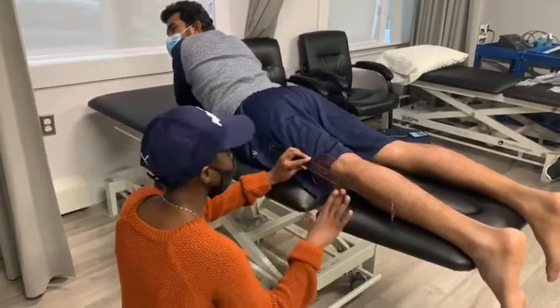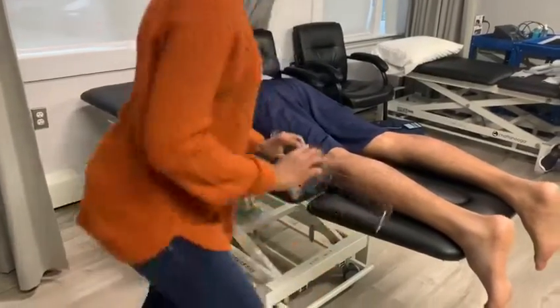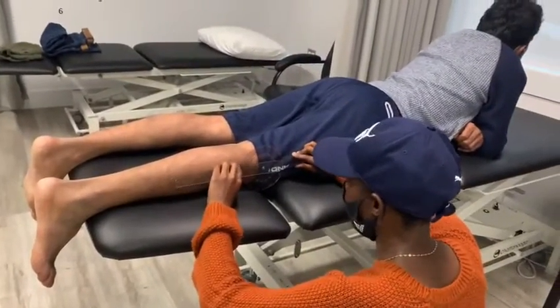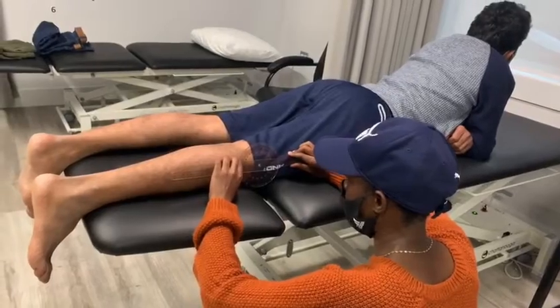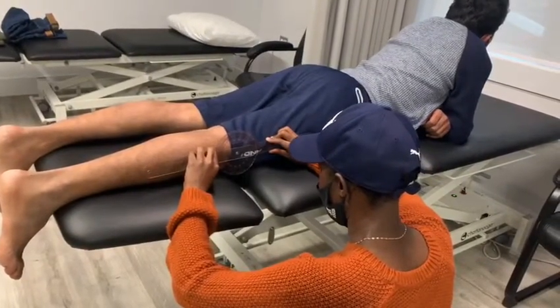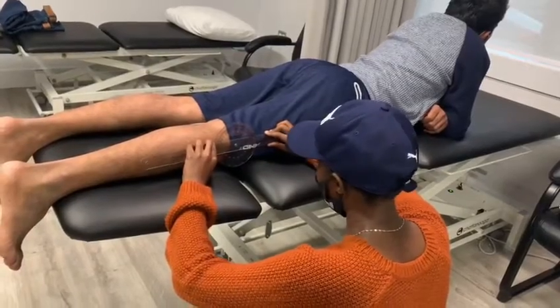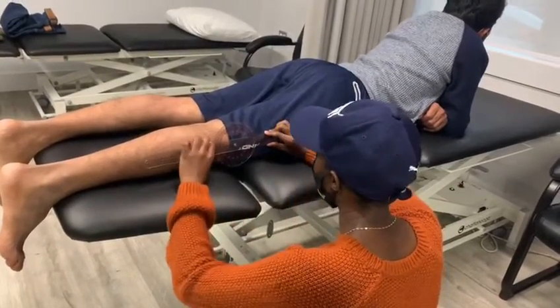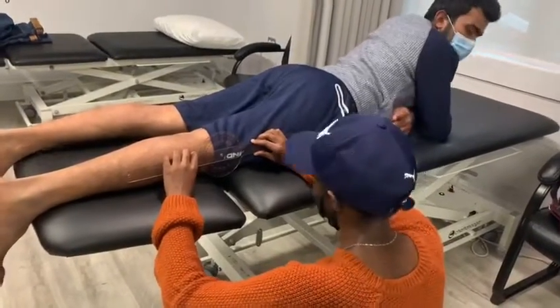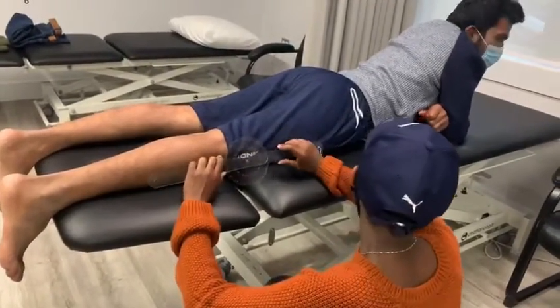The normal range is around plus 10, so that's pretty good. And we'll try on the other side. Try to bring your knee straight. And here it's only 0 degrees, so there's a little bit of limitation. Are you feeling any pain for that? Yes. Because it's stretching the strain.